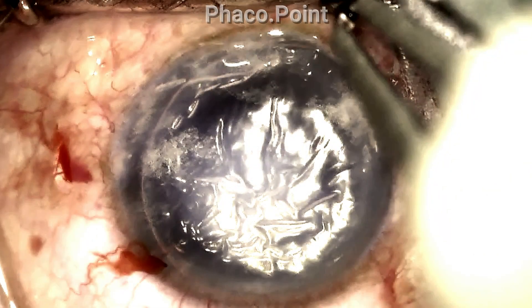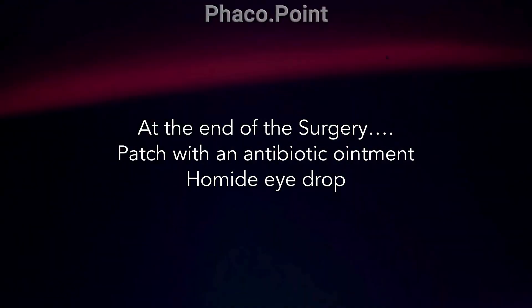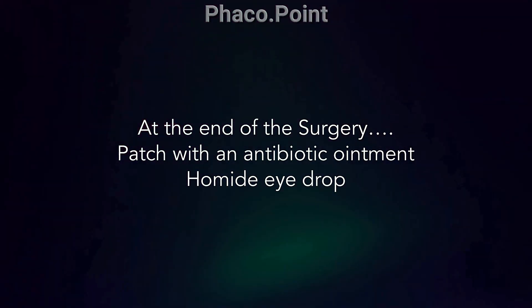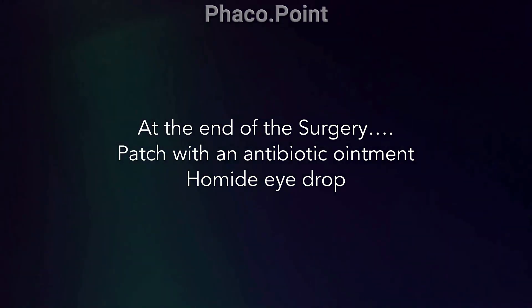Finally, at the end of the surgery, this is what our patient's cornea looks like. The eye is then patched with an antibiotic ointment to promote re-epithelialisation, and one drop of homatropine to prevent a post-operative pupillary block.